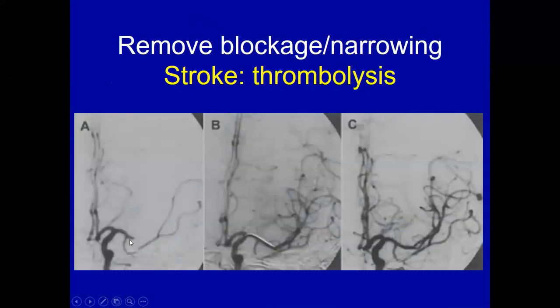And that's another patient. So here is a clot, put wire catheter through it and remove. Or put a catheter, give a patient thrombolysis, which is a clot busting drug, and the patient improves. Okay, questions? So if you notice, we remove blockages in different parts of the body, in the vascular system, in the GI, in the bronchial tree, and so on.